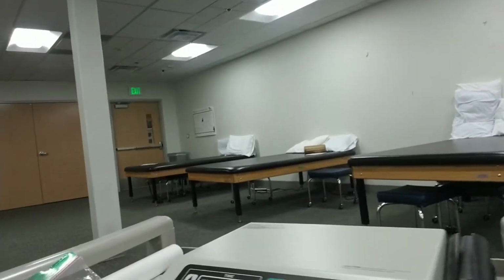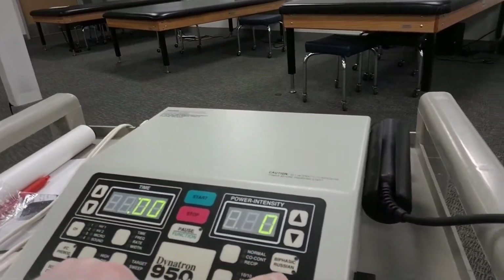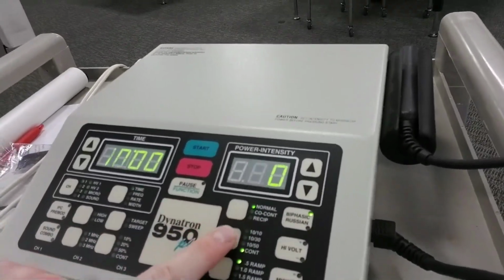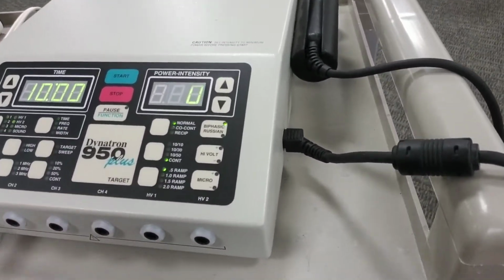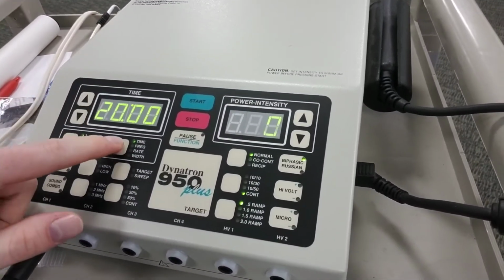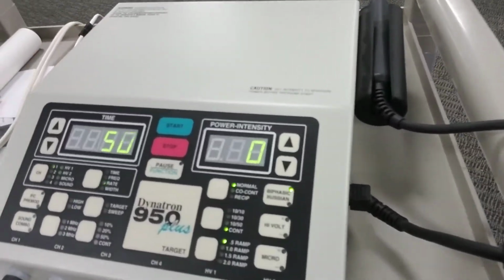All right. So for our machine here, we want to hit start here. I guess it's already on. So we're going to do biphasic, keep it at normal. We want to do continuous. We don't really need any ramp time. For timing, we're going to go up to 20 minutes here. Pulse rate, we said we wanted 80 pulses per second.